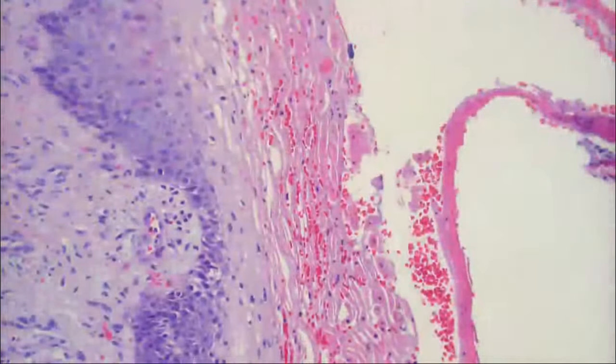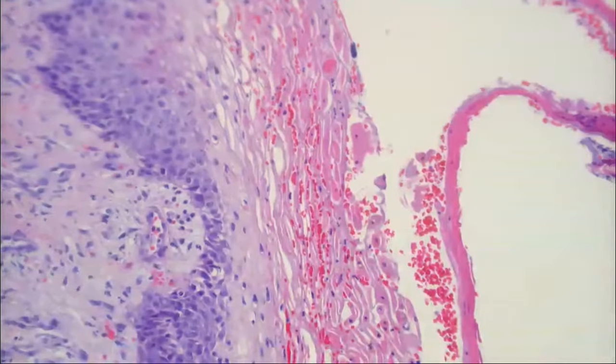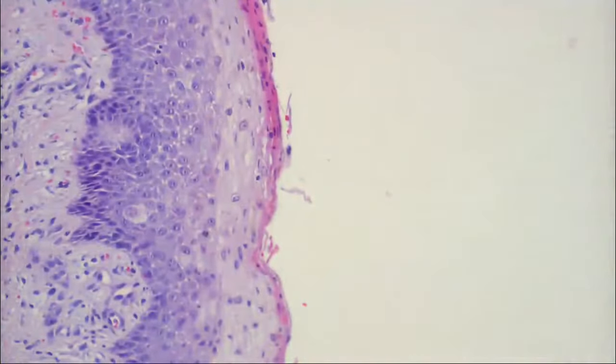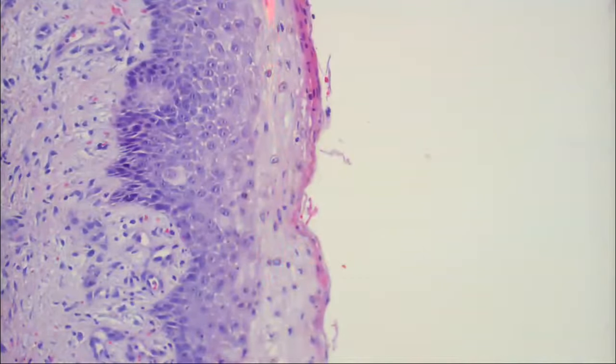And we have a picture of what it looks like here. Well, I'll show you. You can get that in nutritional deficiency. Look at that, that's what it is right there, that photograph. So nutritional deficiency is a fantastic example of that here, and the ballooning is at the top. So there's only about one other thing that will do this. What's one thing in the differential?